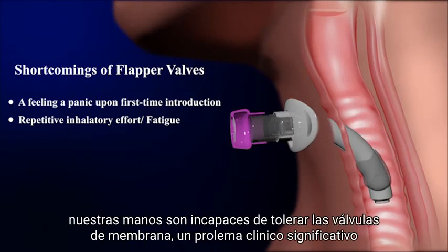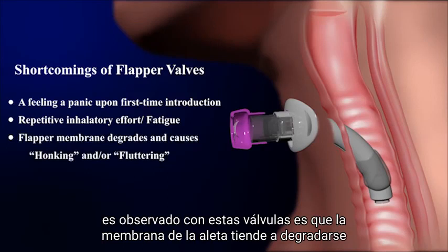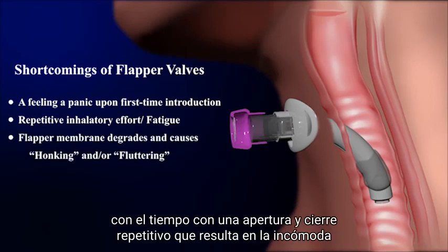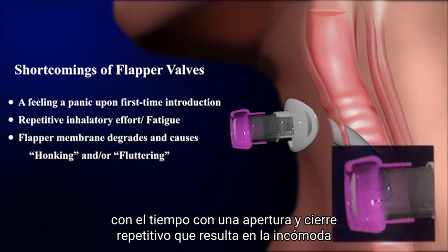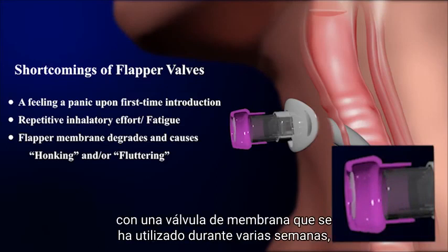One final significant clinical problem noted with these valves is that the flapper membrane tends to degrade over time with repetitive opening and closing, resulting in the uncomfortable honking or fluttering type of noise that is observed with a flapper valve that has been used for several weeks.